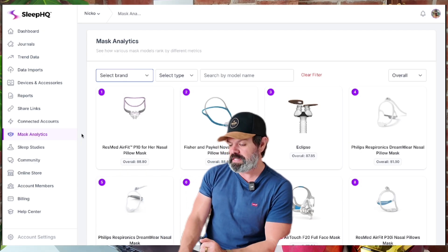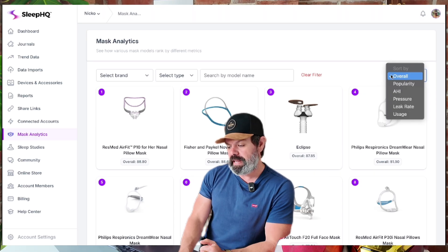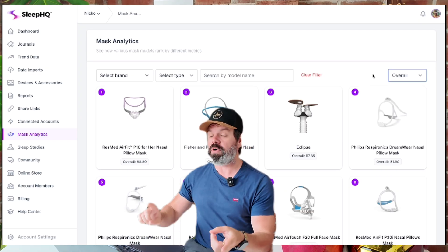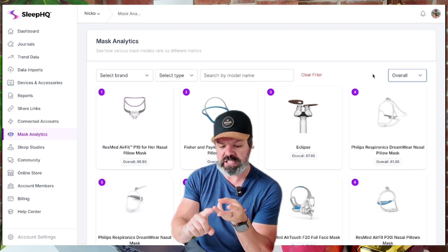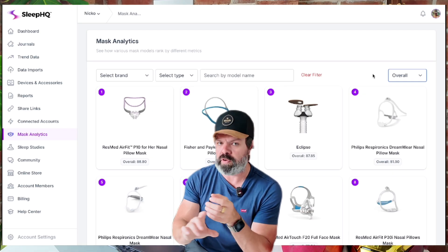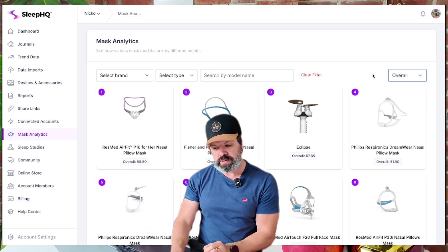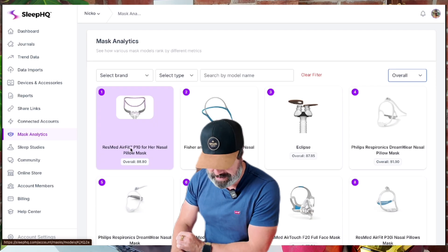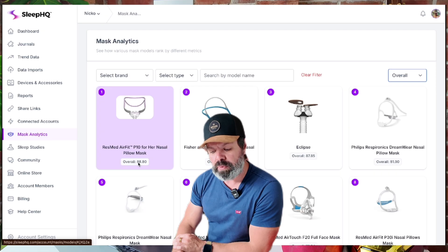This is the cool part. Right now I am sorting by overall. When it comes to this overall score, it's a unique score we're giving the mask based on average leak, average AHI, average pressure, average usage, and popularity. We've got a great algorithm that takes all that information and gives the mask a score. You can see here the AirFit P10 — one of my all-time favorites — currently ranked number one with an overall score of 88.80.